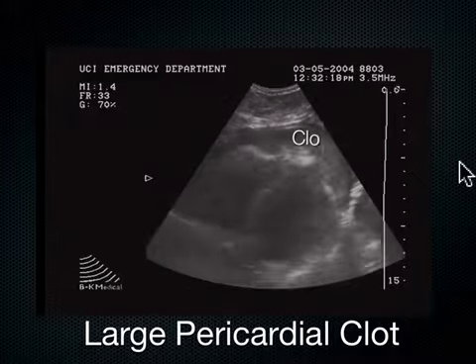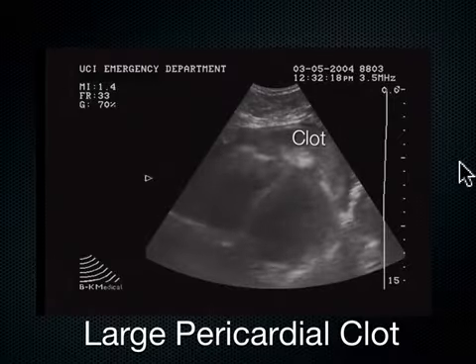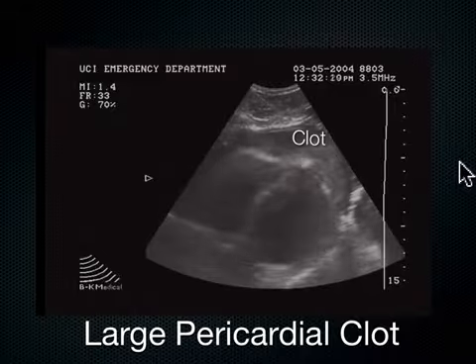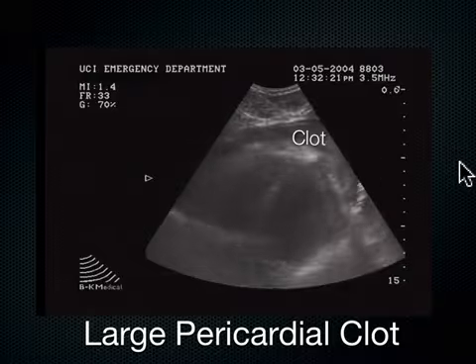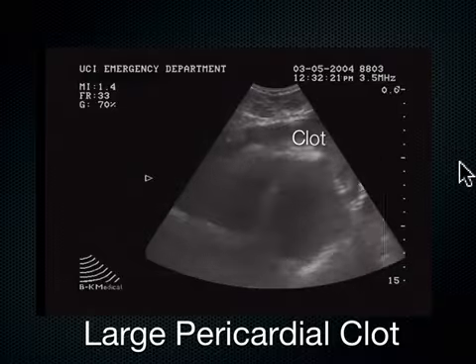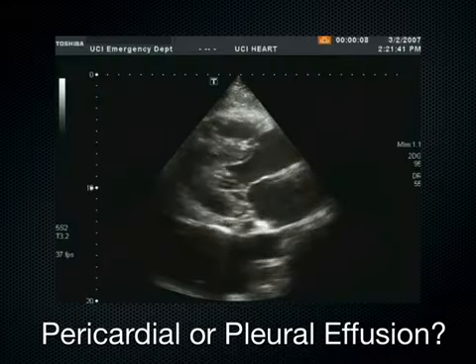But is fat going to ever collapse the ventricle like that? Fat should not cause the ventricle to collapse, no. Very good point. So I see the trampolining ventricle. I see more than 1 centimeter thickness. I see an isoechoic substance in the pericardium. And I really start to make the case that this is a clot. And I see that the patient had a transmediastinal gunshot wound. No, I'm just kidding. Clinically, I am correlating.